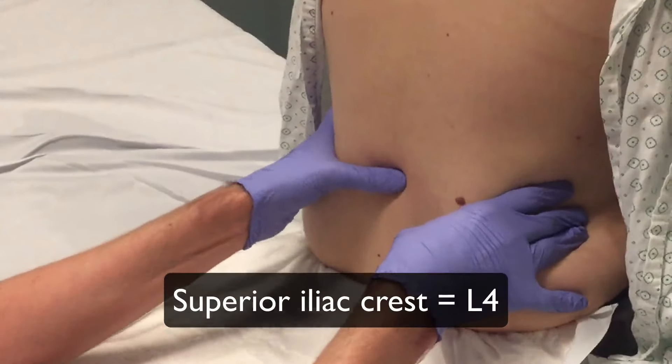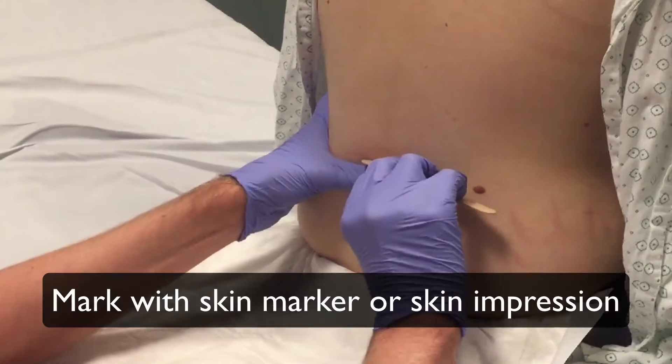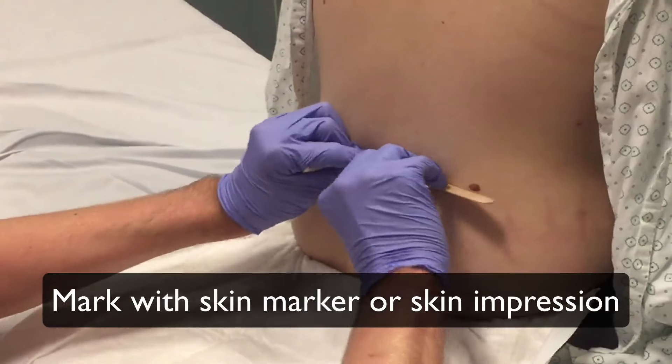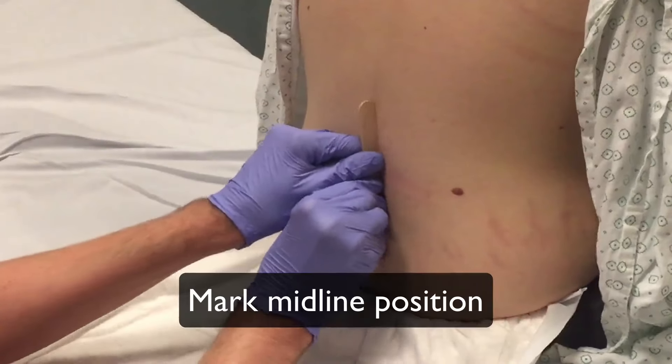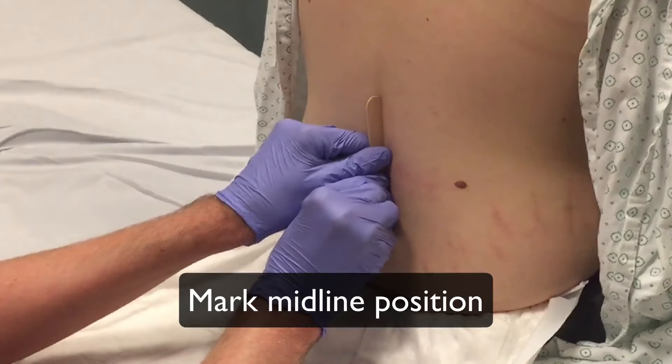Draw a line between the superior aspect of the iliac crest. This indicates the level of the L4 spinal process. Mark this position with a skin marker or make an impression in the skin.